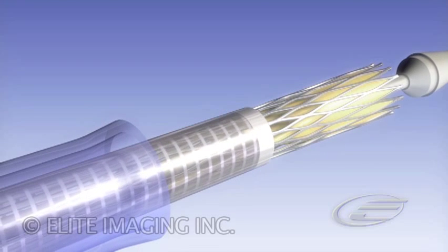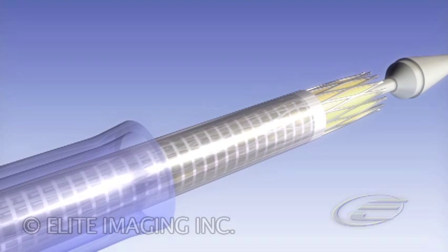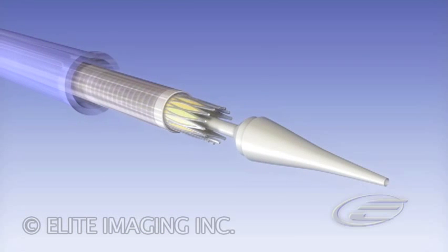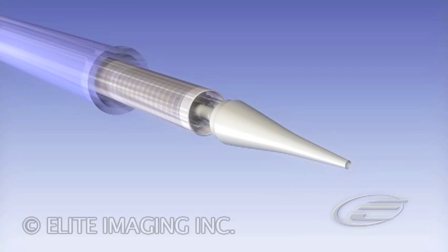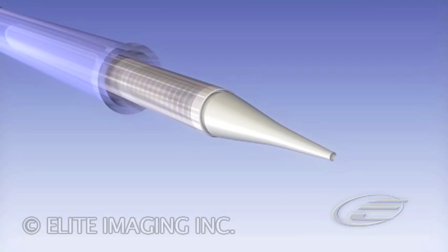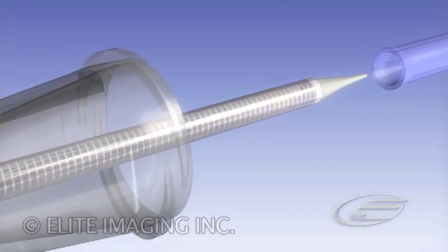Continue to load the valve carefully using the handle and outflow tube. Now use fingers at the tip to push the valve into the catheter to complete the loading process. Remove the outflow tube and outflow cone.